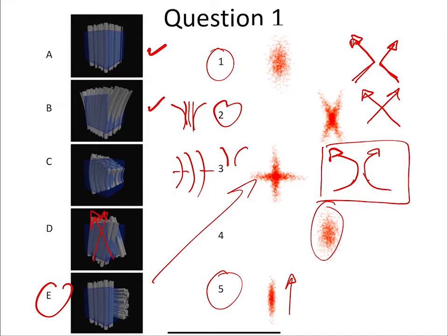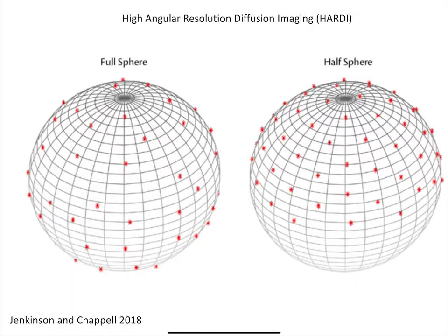Because the MRI doesn't know. You could probably, with some more sophisticated methods, but at first order with a DTI fit, it wouldn't really distinguish that. Assuming the diffusion was equal in both of those, the stuff that goes like this will somewhat mimic the stuff that just went across. So to first order, kissing fibers would appear as crossing fibers, which is a big problem, right? Because you're supposed to track them this way, but you're tracking them this way. Okay? Any other questions? Okay.